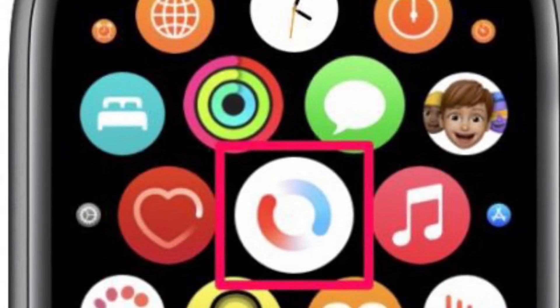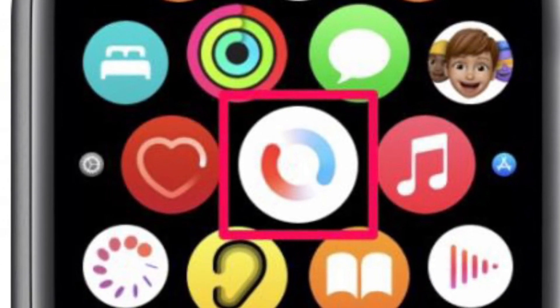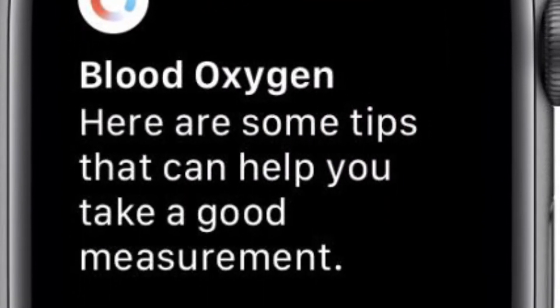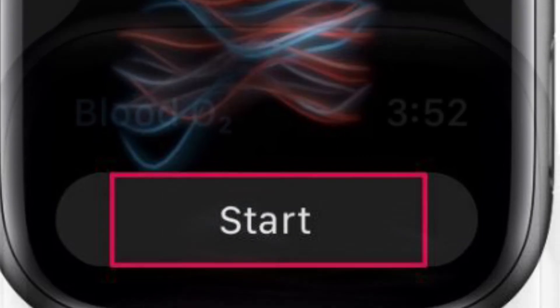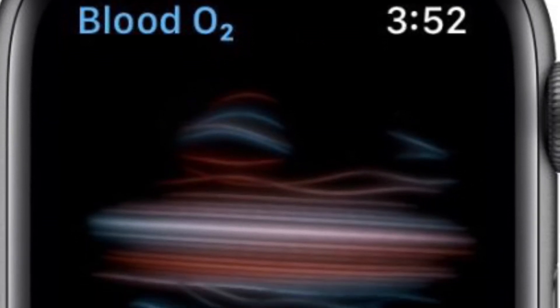Scroll around and find the Blood Oxygen app and tap on it. You will see the welcome screen, and upon tapping the next option you will be shown tips to help you accurately take the measurement. Make sure your Apple Watch is not too low on your wrist and the watch band is snug.